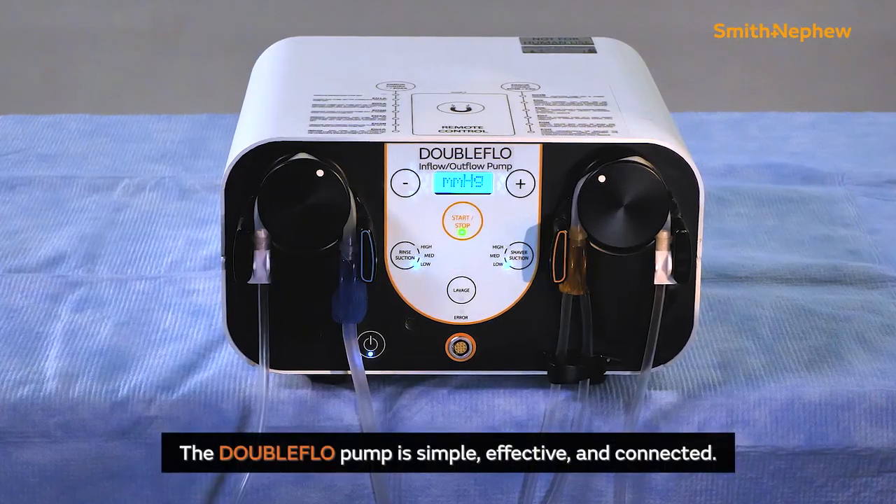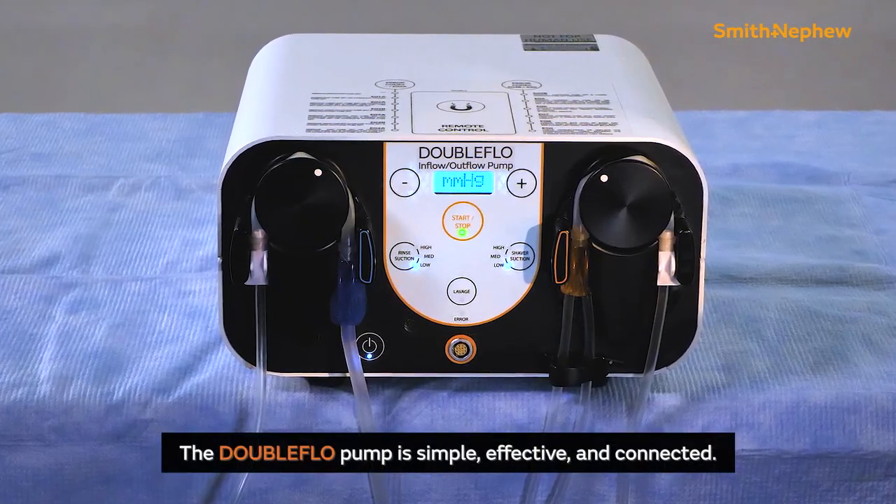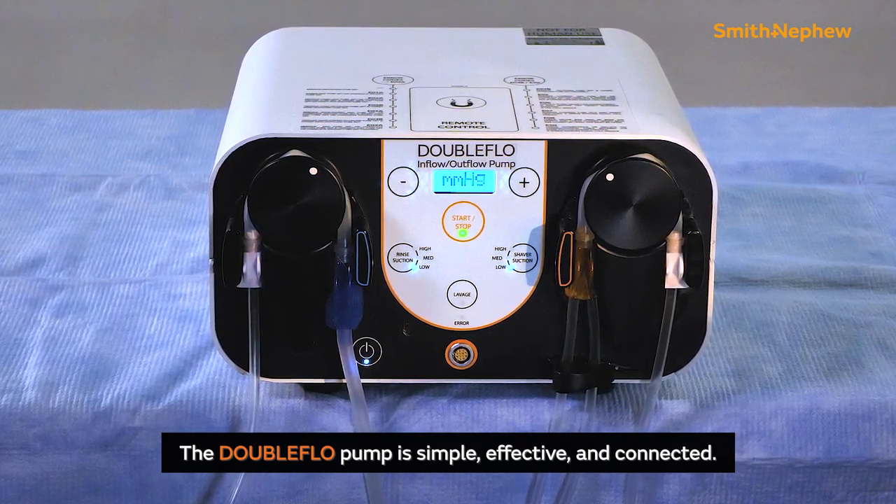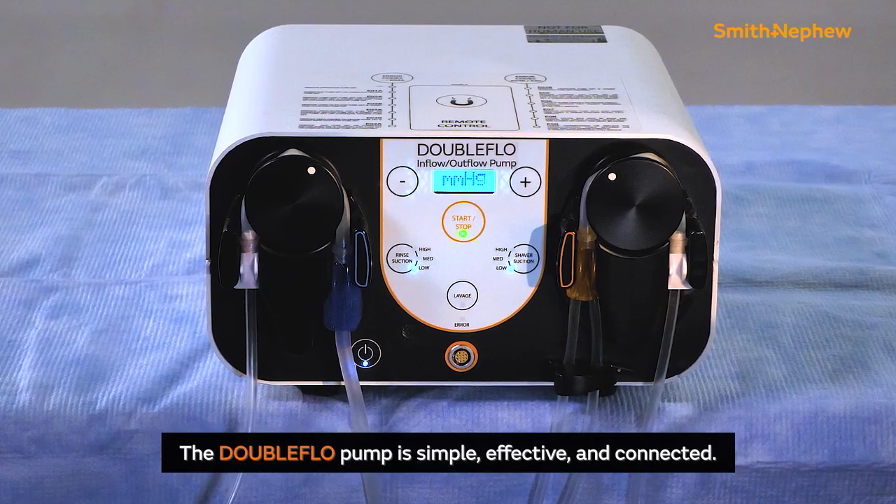The DoubleFlow pump is simple, effective, and connected. It is designed to minimize setup errors and mid-procedure adjustments so busy surgeons and staff can focus on the patient, not the equipment.